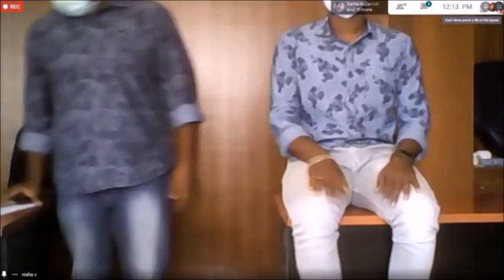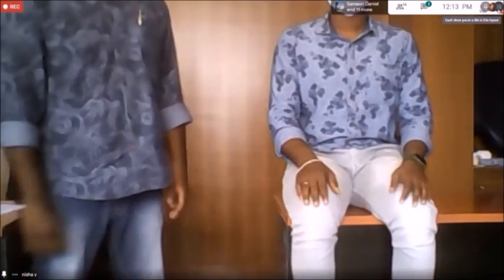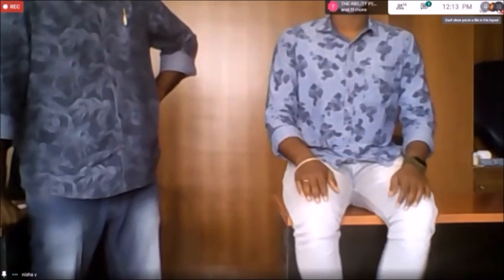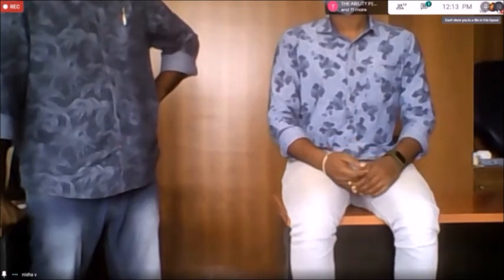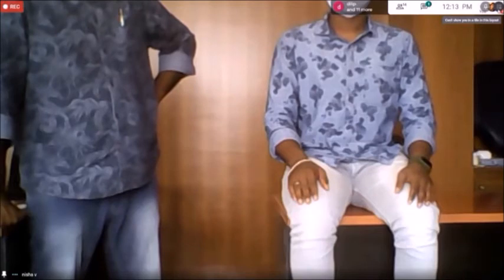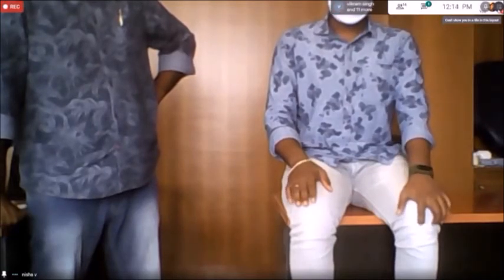And here we are going to observe the hip alignment. As you can see, there is a slight amount of abduction, and there is a neutral rotation of the hip. And the hip is obviously in flexion because he is sitting. So this is what you can see right now. And the other thing that you can see is, is this abduction too much or too little? Because if it is too much, then this will have an impact.